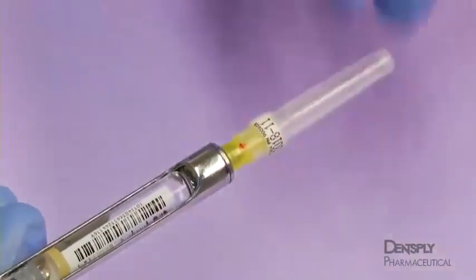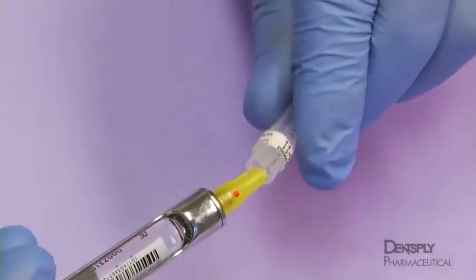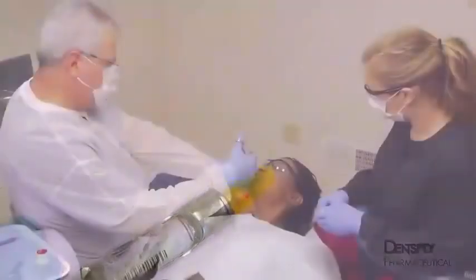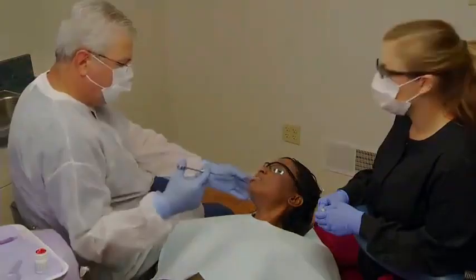A possible answer to this problem is to bend the needle approximately 15 degrees at the hub. Then the syringe can be kept off the mucosa as the needle is advanced posteriorly.